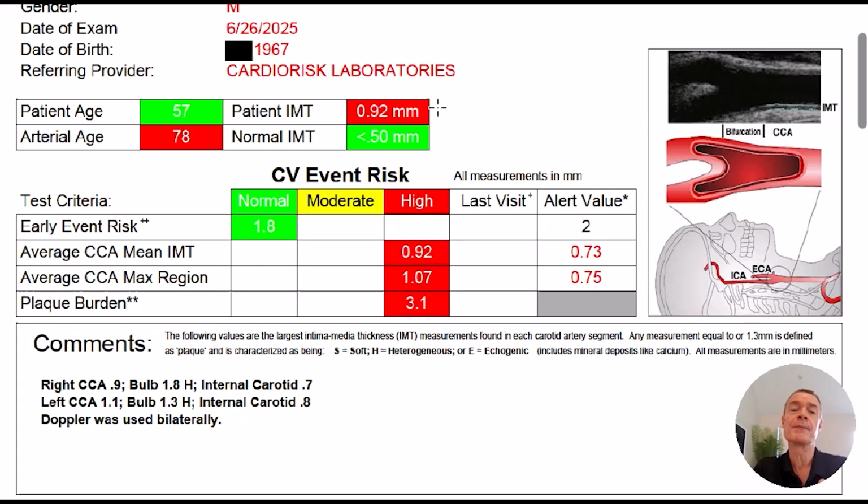To say that you've got real biological change from one IMT number to another, you've got to be greater than 2 standard deviations, in other words greater than at least 0.04, right? And arguably you could say 3 standard deviations. You've got to get beyond the measurement noise to say, okay, now probability-wise, you're looking at real physiological, biological change as opposed to just measurement noise. So that's the standard deviation for IMT.